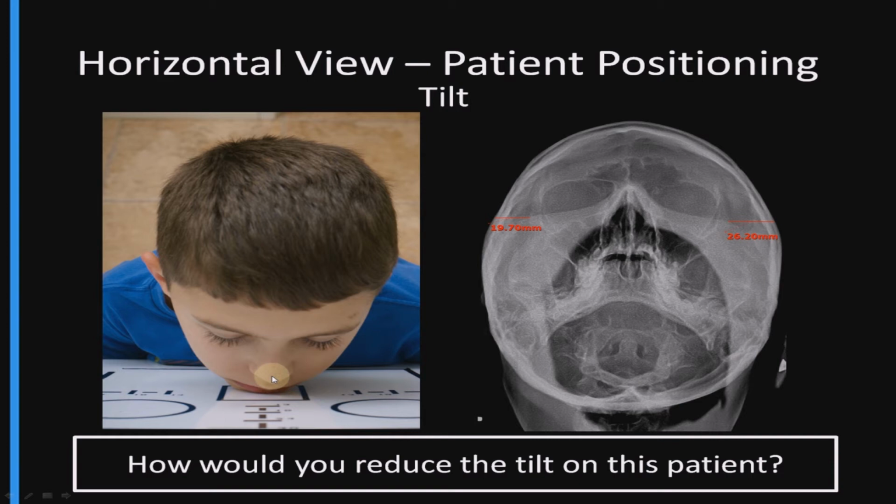we would back the patient away from the film slightly, slide the chair towards the side of head tilt, then bend the patient at the waist back towards center, and reposition their chin upon the center of the film once again. At that point, you would recheck with your fingertips underneath the mastoids and recheck your central line to see if the glabella and the nose and the frenulum are all in line, and that would let you know that you have accommodated for the head tilt.